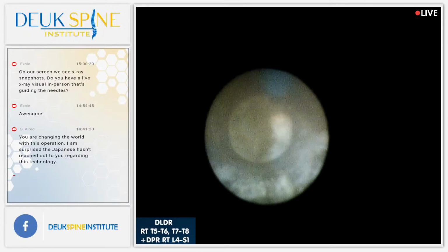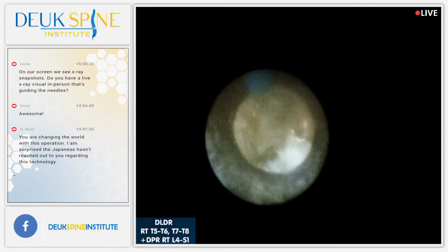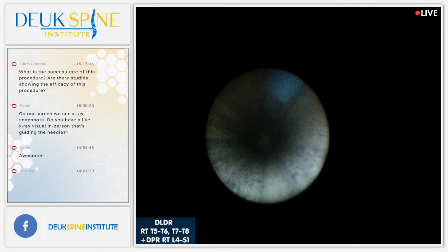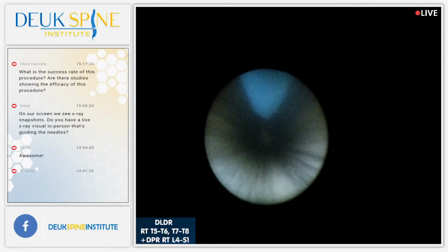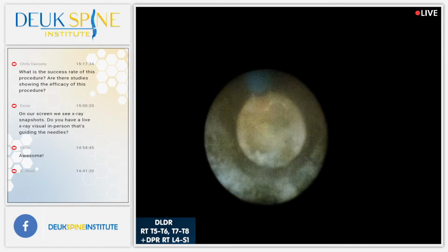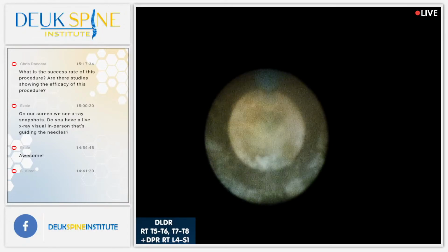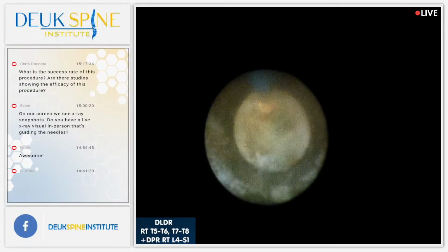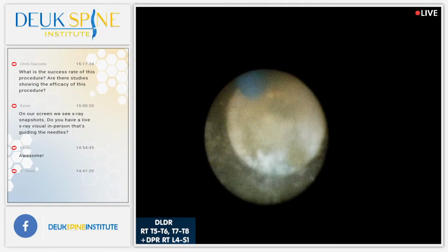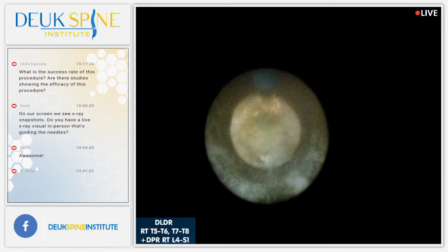Think about if you're navigating in a car or a boat. You don't need to continuously think, am I in the right place? Am I in the right place? Constantly, right? You just use waypoints, like a certain corner, a certain building, a landmark, and you know you're in the right spot, and that's what we as surgeons use. It's pretty common for surgeons to use snapshots on the X-ray as waypoints to confirm where they're going. And you take those pictures when you're near sensitive structures to make sure you're not in the wrong place.